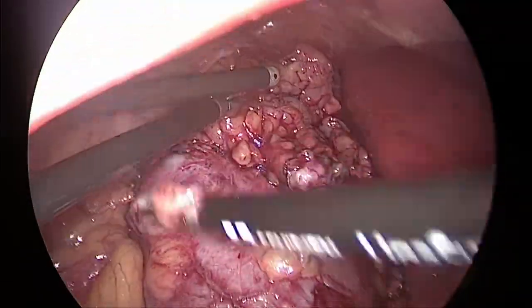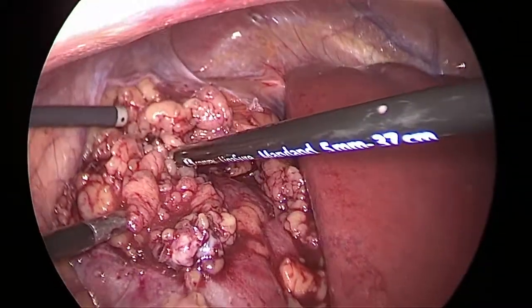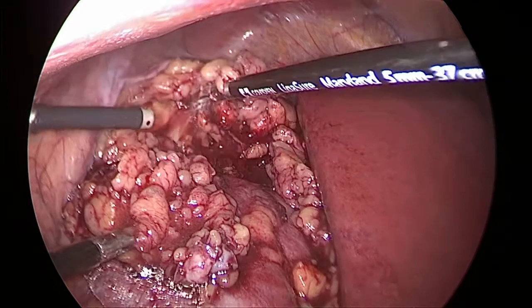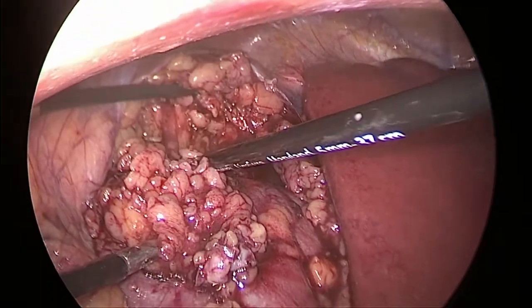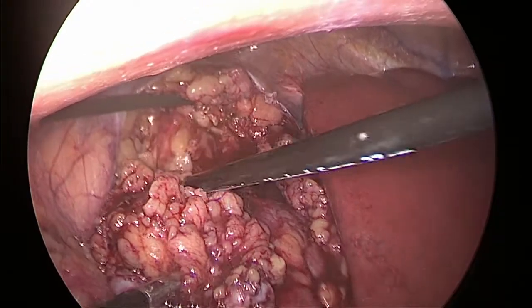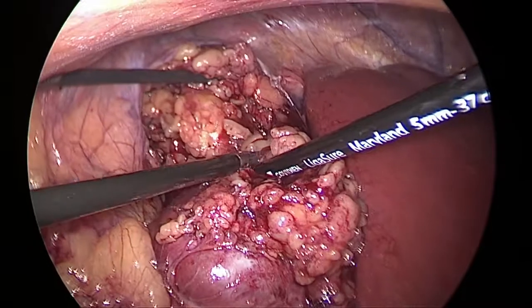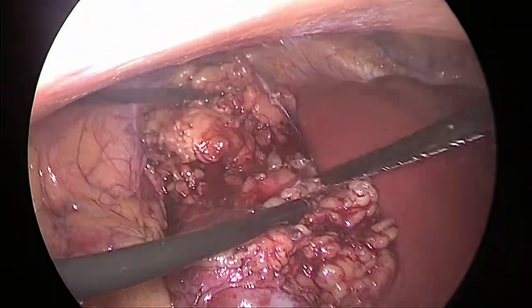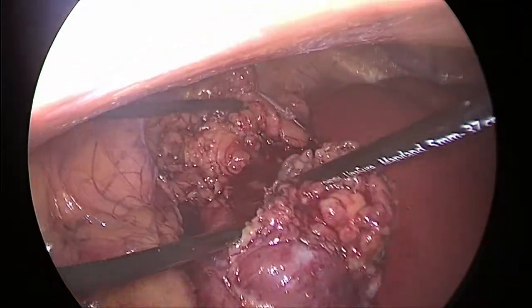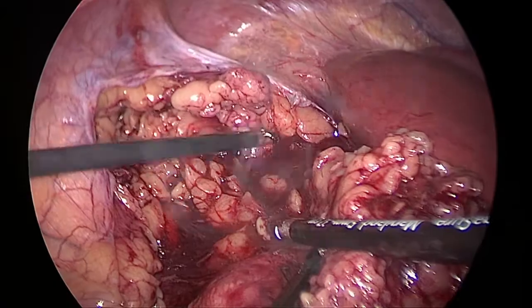I am struggling for complete mobilization of the kidney. Now the mobilization is almost complete.